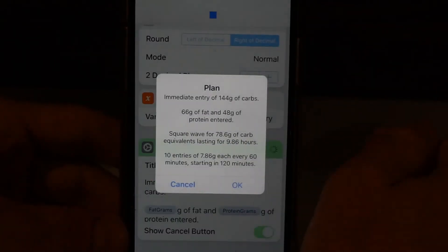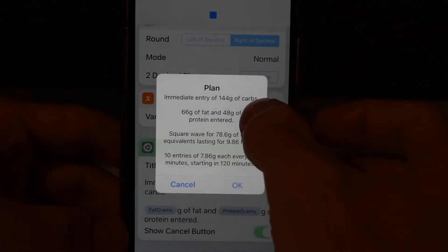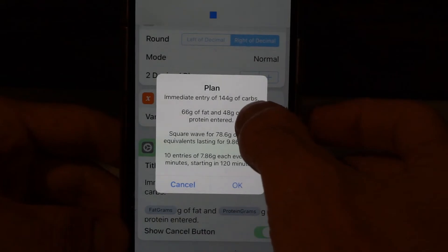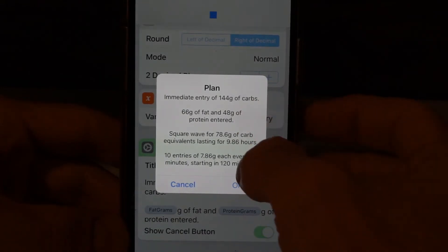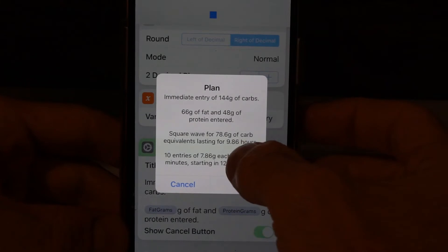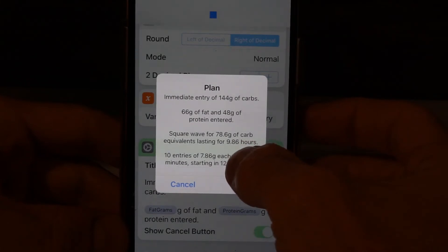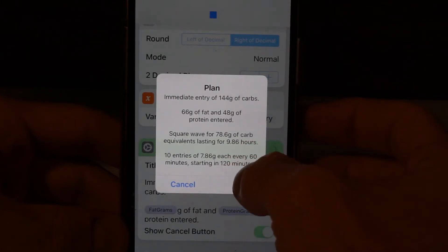If I had entered several foods, I can click on several of these and the shortcut will add them together. Here's the protein — 48 — and then it runs and says it's going to do an immediate entry of 144 grams of carb, and then a square wave for the equivalent of 78.6 grams of carb over 9.86 hours.